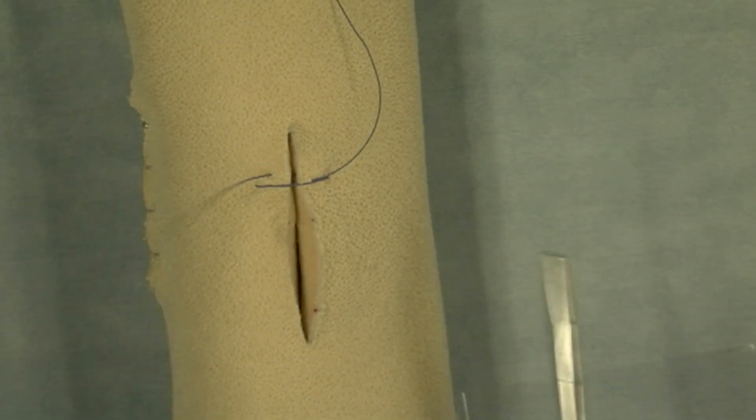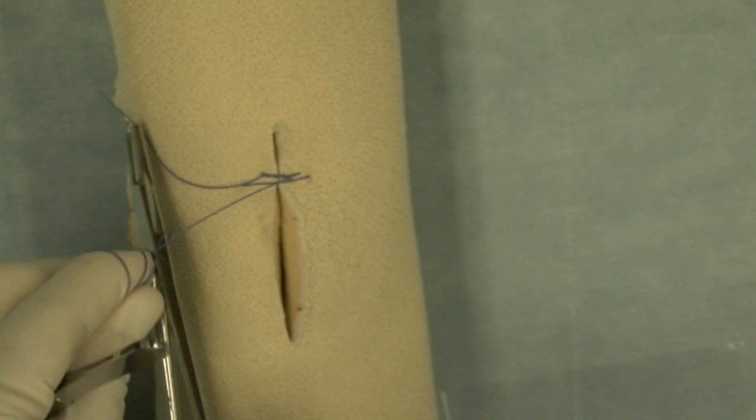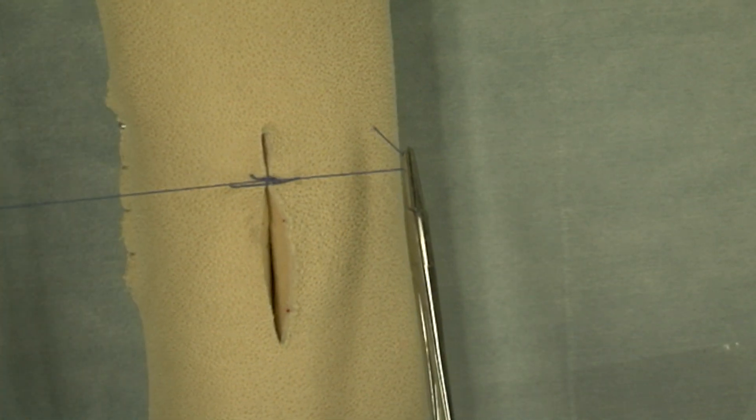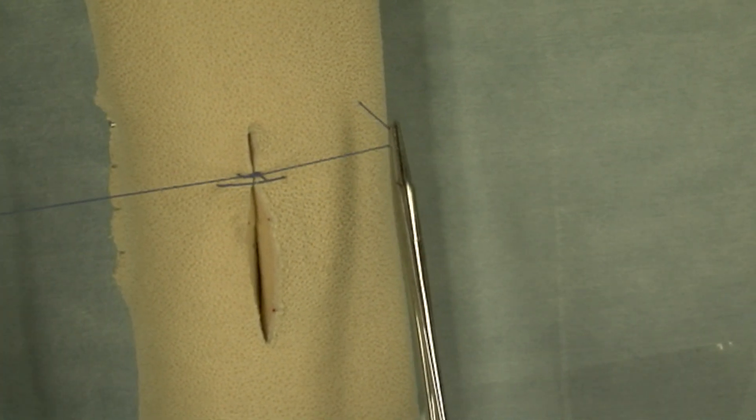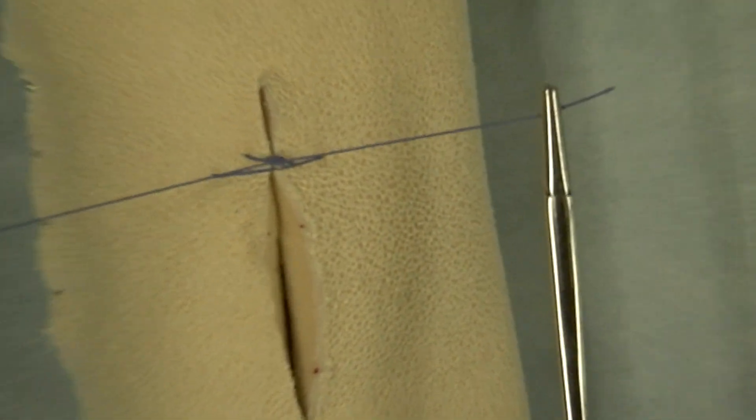So in order to get this tied properly I'm going to use a surgeon's knot comprised of a surgeon's throw followed by a simple throw. And you can see that that takes up the tension and is tied properly with the proper tension on the suture ends.